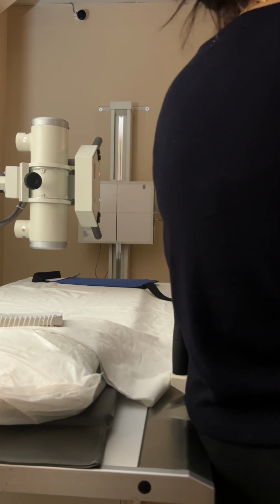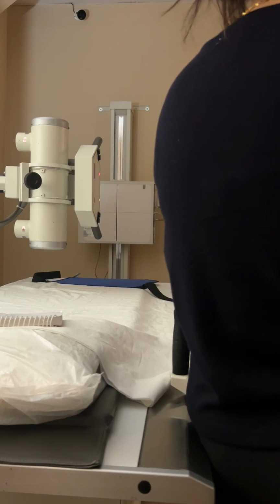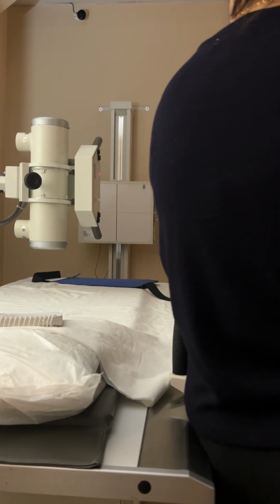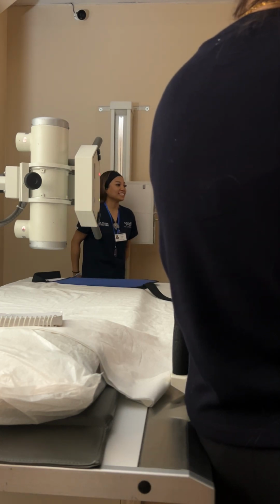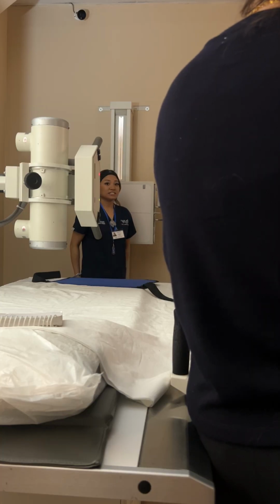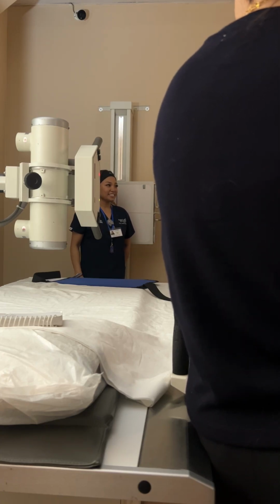Have you inhaled first? Take one big inhale. Remember, they don't necessarily know what inhale means. Take a big breath in, and then blow it all the way out. Then I'll have you take another one. Inhale in, and then hold, and I'll take the picture. Great. And don't forget to tell them, hold that breath, don't move, don't breathe. Because if you don't tell them not to move, they're going to ask, are you taking it now?